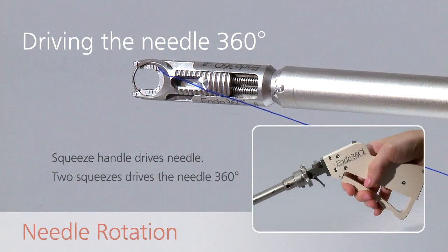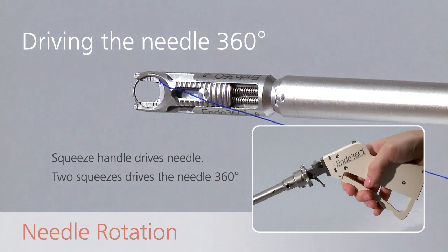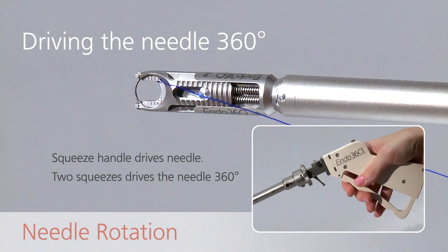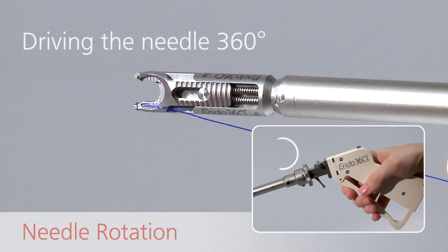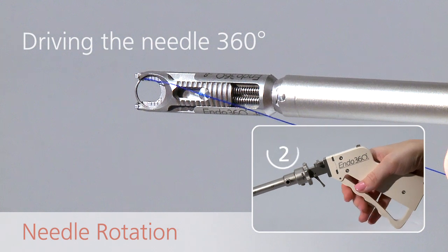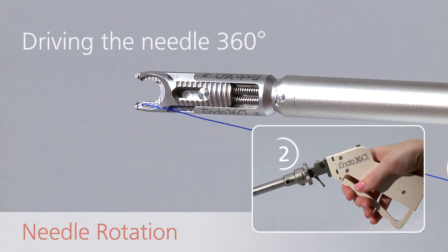Squeezing the handle twice — in-out, in-out — drives the needle completely around in a 360-degree circular path. The first squeeze drives the point of the needle 180 degrees and through the tissue. The second squeeze picks up the point of the needle and brings it back 180 degrees to its starting position.